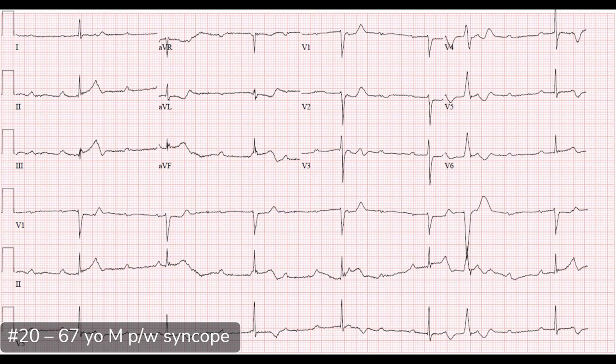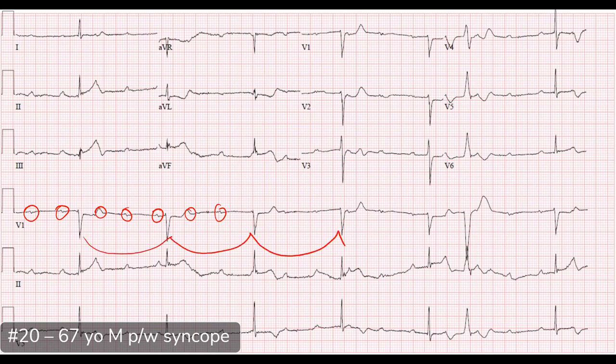Looking at the ECG and the rhythm strip, I do see P waves. It doesn't look like they line up really well with the QRS complexes. If we walk them out, the P waves look to be regular, and the QRS complexes look regular as well, but it doesn't seem like they're talking to each other. It looks like there's complete dissociation. I'm concerned this is a third degree heart block or complete heart block. The axis looks normal, intervals look relatively normal, and this is a narrow complex QRS.